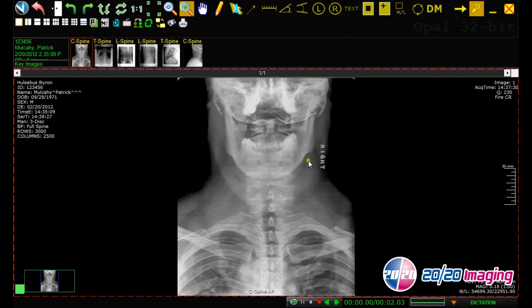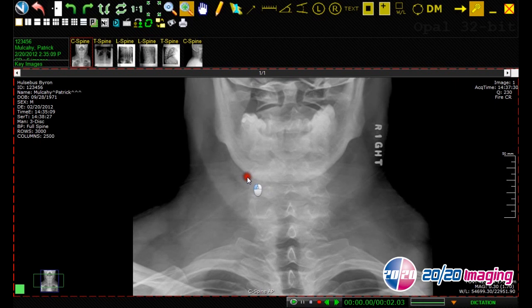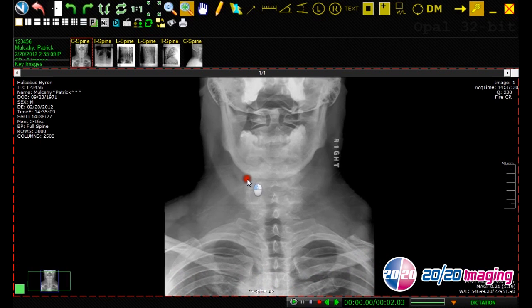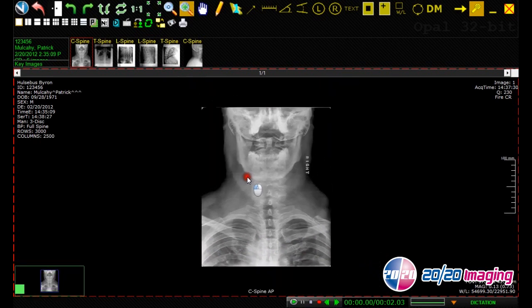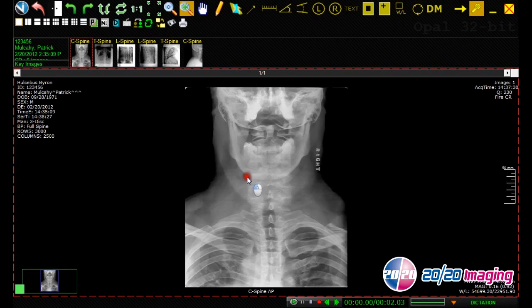The zoom tool allows us to increase or decrease the overall size of the image. By left clicking and holding down the left mouse button and rolling the mouse forward, we can increase the size of the image, and by holding the left mouse button down and pulling the mouse backward towards us, we can decrease the size of the image.